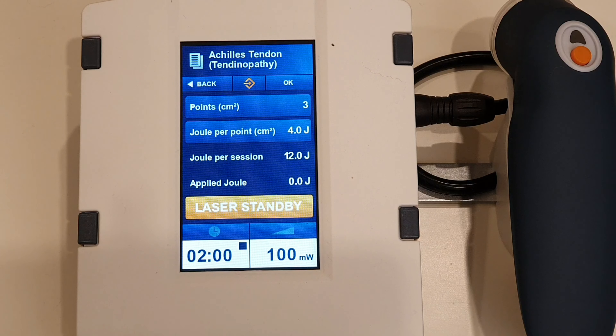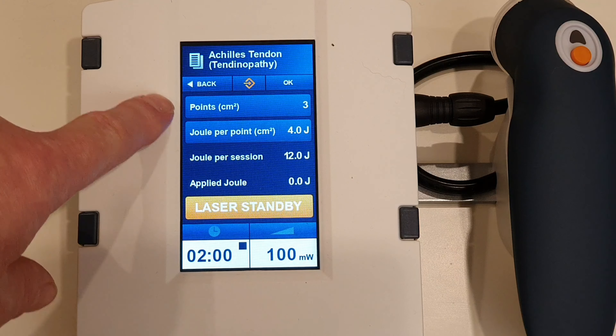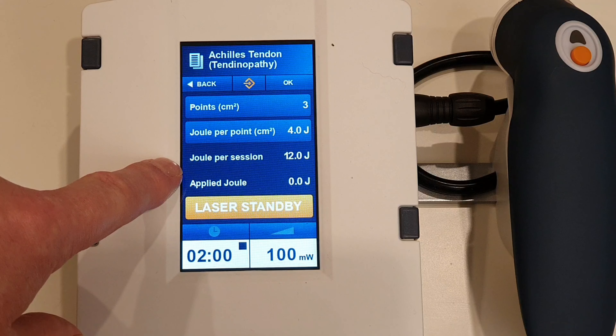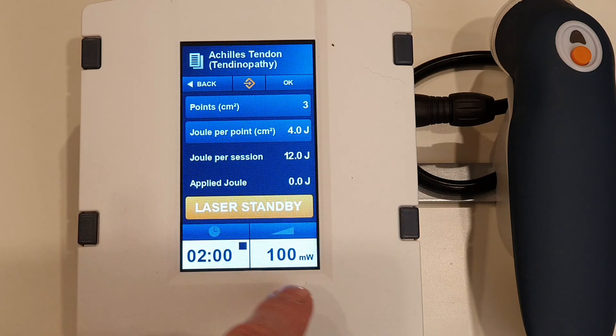You'll see here I'm using a single 800 nanometer laser diode. We're going to be doing three points, four joules per point, giving us a total of 12 joules at 100 milliwatts. That's going to take us two minutes. We don't want to be much above 100 milliwatts — that's about the maximum recommended for tendonitis in the Achilles. We'll go and treat the patient.